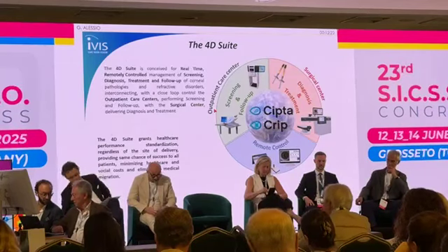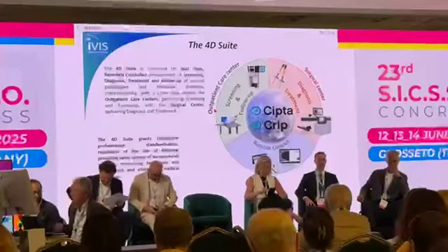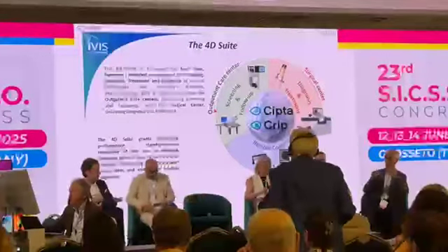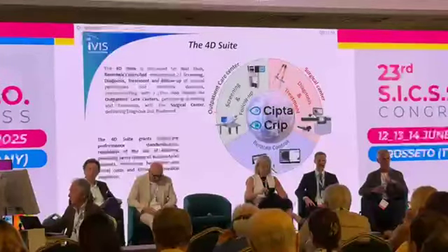You have to imagine that there are two big rooms. In the first, we can screen and follow up the patient, and in the second room, we perform the surgery and the treatment. Both these rooms are remotely controlled, and this is the innovation and the very important thing.